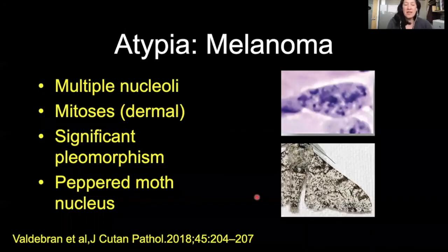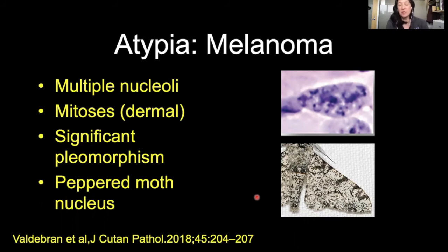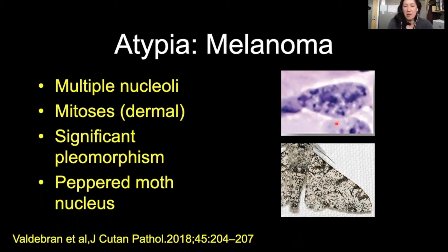When we take that to the extreme of melanoma, you're going to see multiple nucleoli, dermal mitoses, more significant pleomorphism, and something that Dirk Ellison likes to refer to as the peppered moth appearance of nuclei. On the bottom right, here's our peppered moth. In the upper panel, this is a melanocytic nucleus showing that chromatin all broken up and dispersed in that peppered moth pattern.